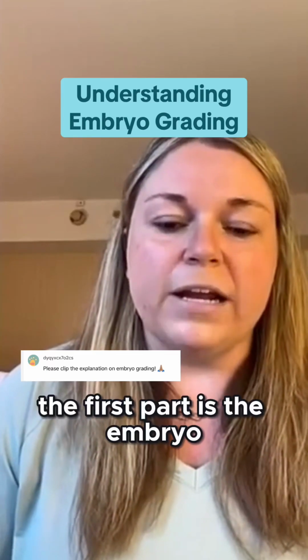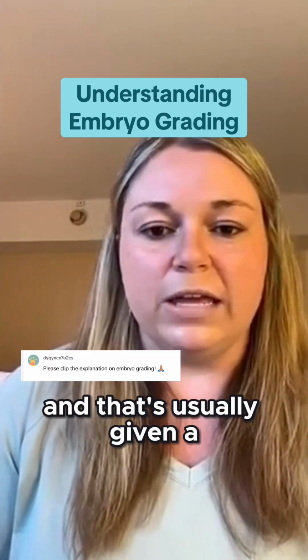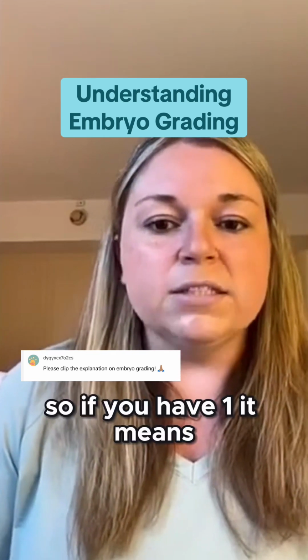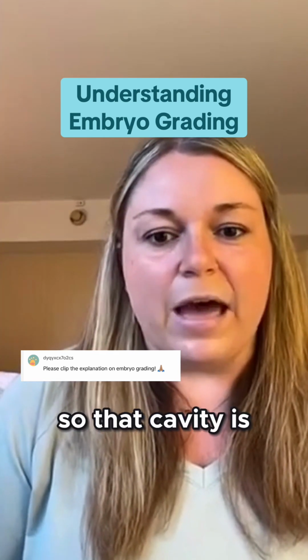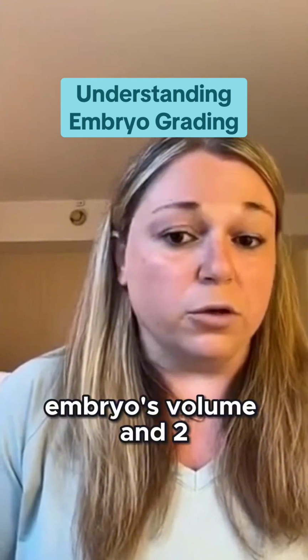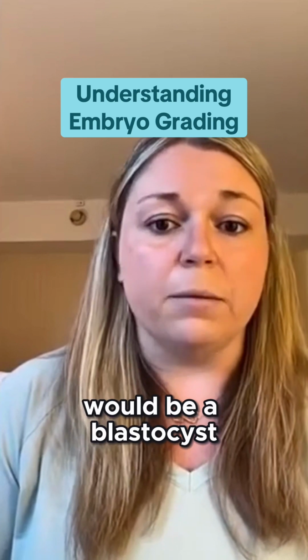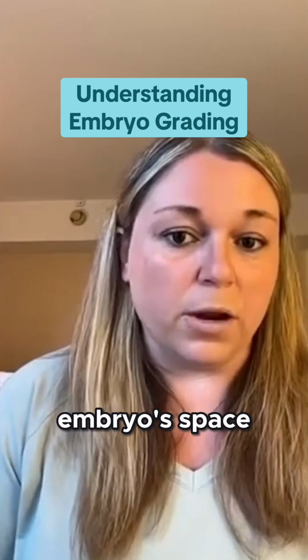The first part is the embryo stage of development or its level of expansion, and that's usually given a 1 to 6th grade. So if you have a 1, it means the embryo is at the early blastocyst stage. So that cavity has just started to form, but it takes up less than half of the embryo's volume. A 2 would be a blastocyst, which means that cavity has taken up more than half of the embryo's space.